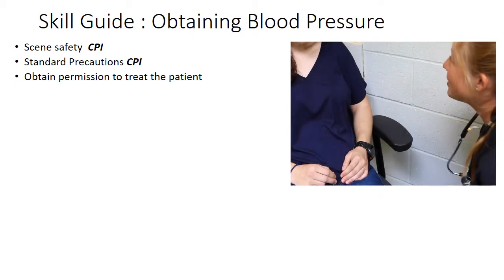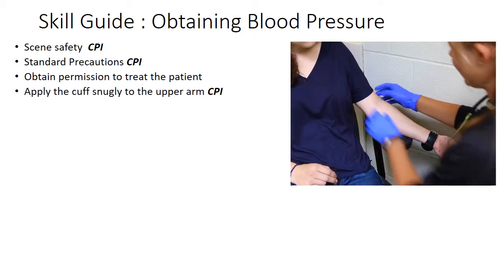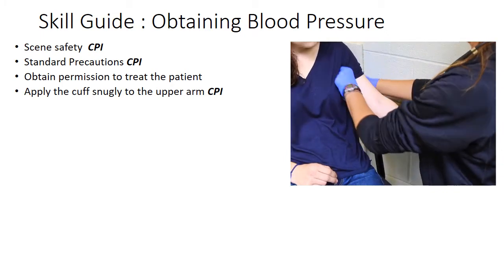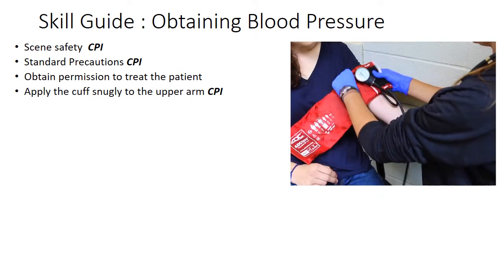Is it okay if I take your blood pressure? I'm just going to have you put your arm right here out like that. I'm going to roll up your sleeve a little bit. Apply the cuff snugly to the upper arm — I'm going to take the sphygmomanometer and put it on here.